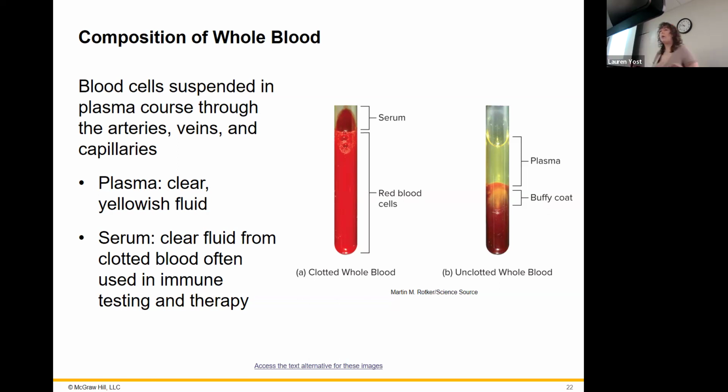so that the red blood cells don't clot. So we have over here the unclotted whole blood. It's unclotted. I want to be clear. Unclotted. You see it down there in the bottom. You think, oh, that looks clotted, though. It is not. It's just that we've centrifuged it and separated out the red cells from the liquid portion.